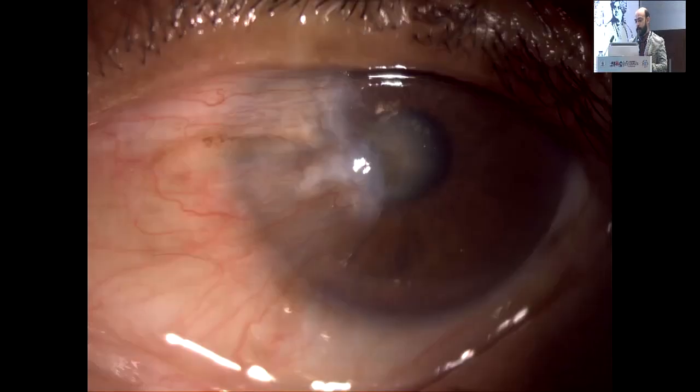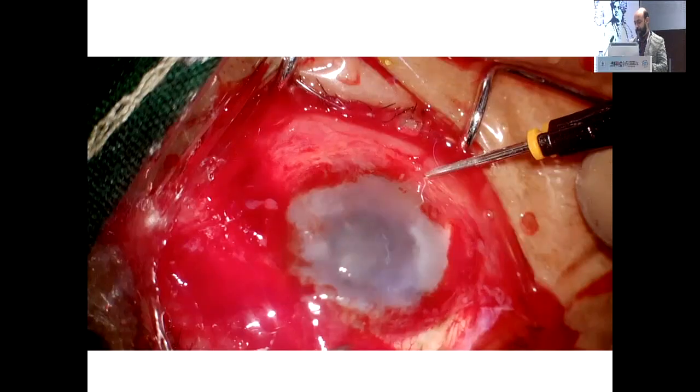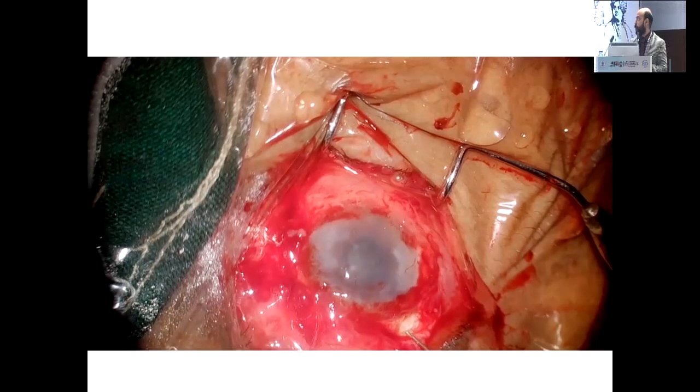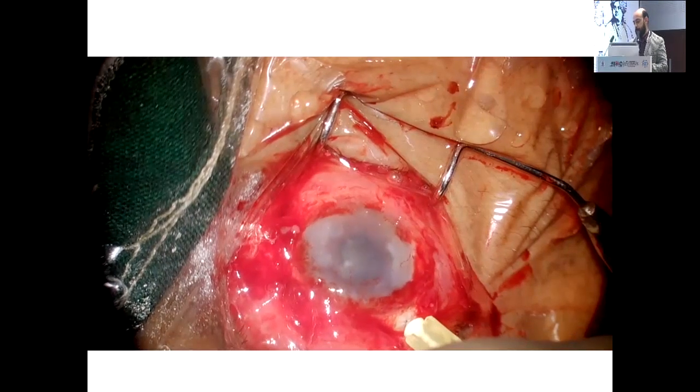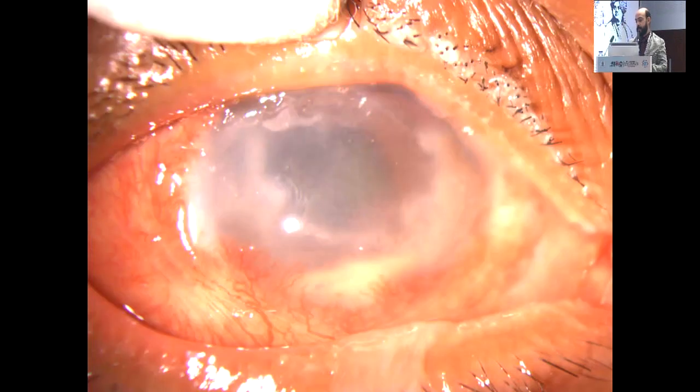So this was the other eye of the patient. I did a B scan and could find some membranous echoes, so I labeled it as endophthalmitis and moved on to do a pars plana vitrectomy. Visibility was extremely poor, even though I had cleaned up the anterior chamber. However, I could see the disc, and after a core vitrectomy, I went ahead and injected voriconazole, Ampho-B, along with vanco and imipenem. Initially, the patient seemed to respond, but within the next 3 days, the patient had worsened, with an increase in hypopyon and an increase in corneal infiltrate.